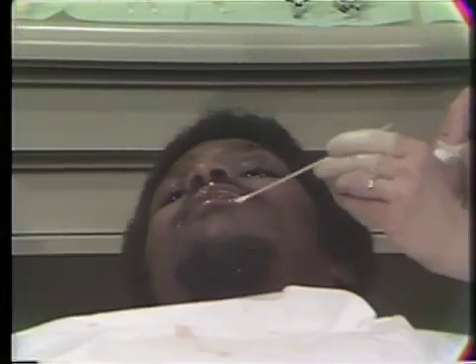Now she's applying lanolin to the lips, because during the periodontal procedure we do an awful lot of tugging and pulling on that poor patient and on his lips, and it's quite comforting for him to have this lanolin on there. And she blots off the excess so his lips don't look too shiny after she's applied it, but it's a lot more comfortable for him when she's through.